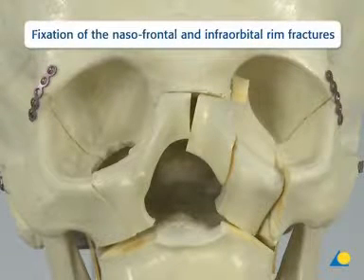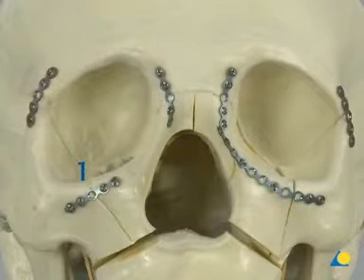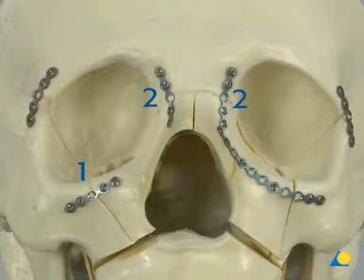Now comes the plating of the naso-frontal and infra-orbital rim fractures. First, after reduction of the medial nasal-maxillary segment, plating of the right infra-orbital rim is completed. Second, the naso-frontal and infra-orbital rim fractures are plated with 0.5 mm thick plates, with at least two screws inserted on each side of the fracture. Third, reconstruction of the left orbital rim starts with anatomical realignment of the fractures.